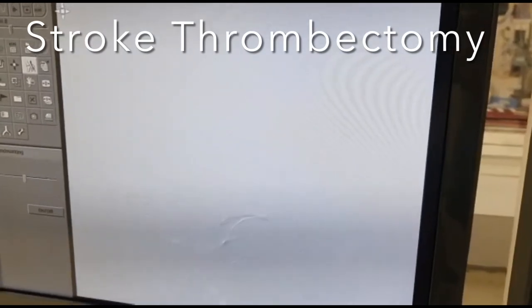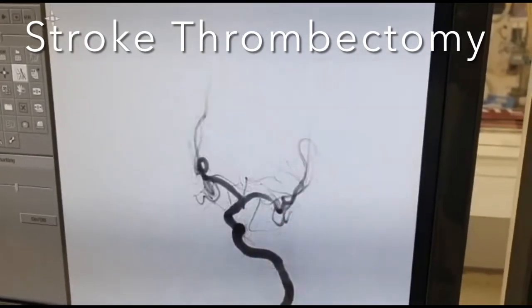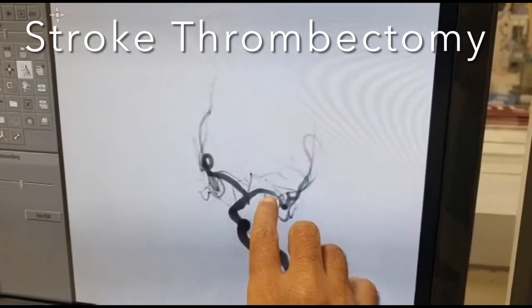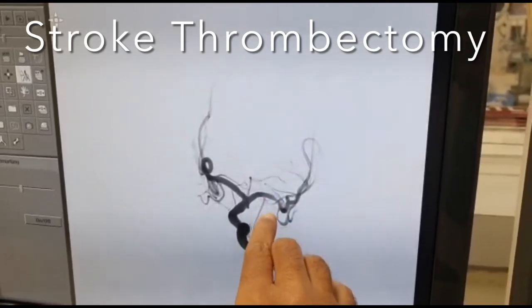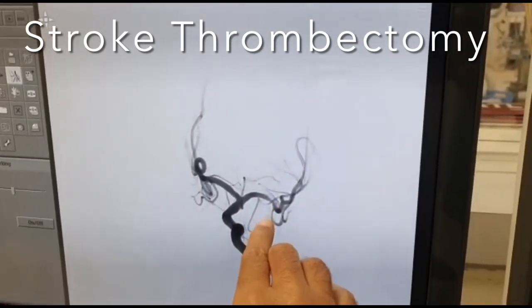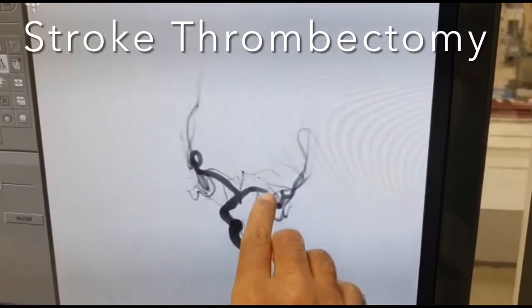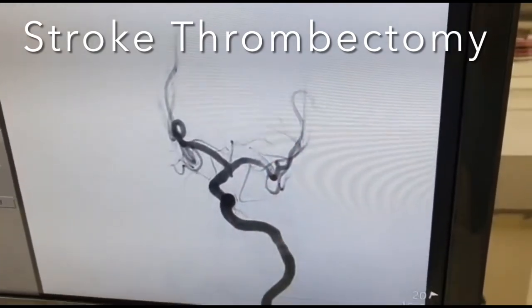Check angio after that shows that the vessel has opened significantly. You can see that there is minimal narrowing here. This is the lower division — there is minimal spasm of the lower division. The upper division is significantly okay.